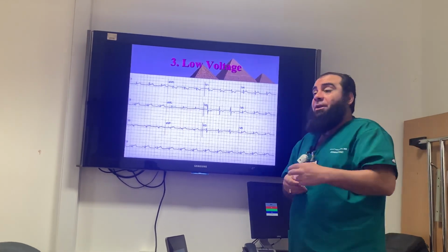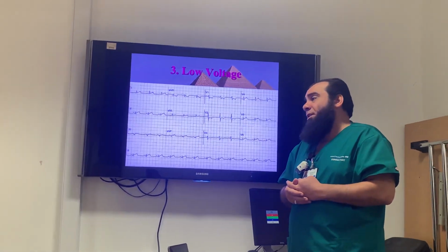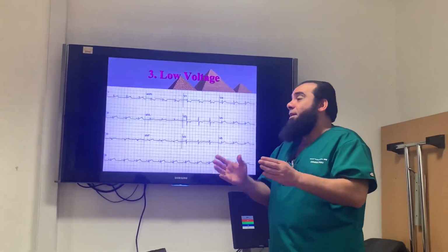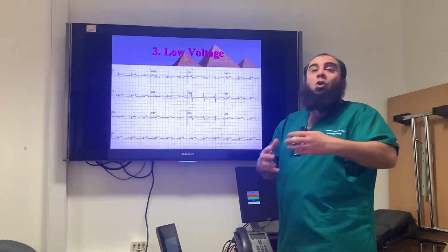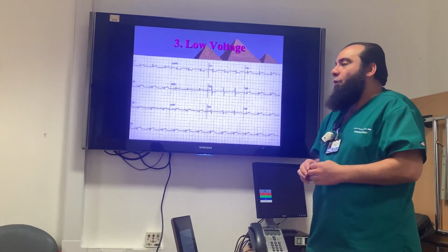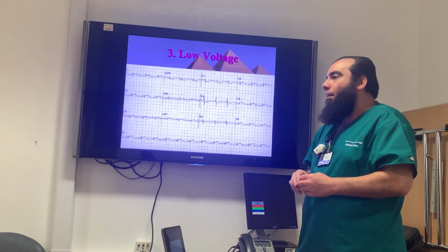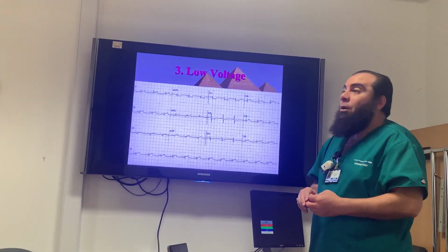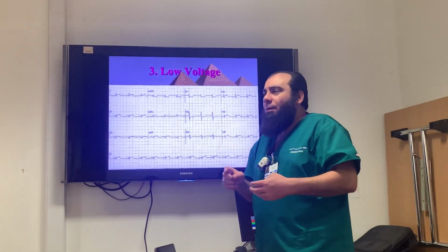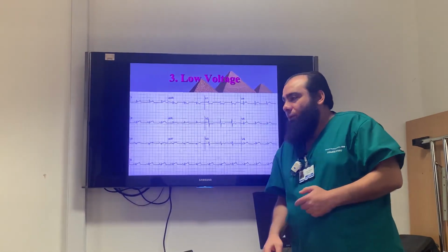You can't say, oh, this patient might have pneumothorax. It doesn't work this way. That's why it is of low significance. It's something to observe: why is he having low voltage? Then you can look for what's going on, but it is not diagnostic for any of them. A lot of COPD patients will have this because of their emphysema. Theoretically, yes. Unless he is slim, then he can show a normal voltage.